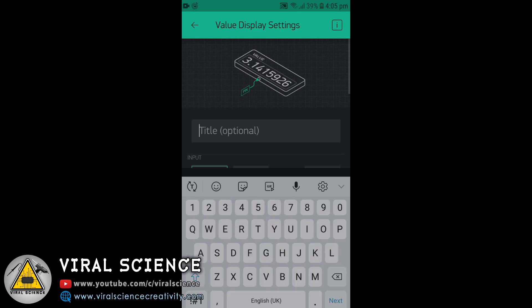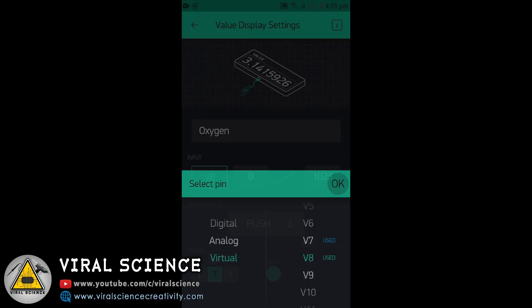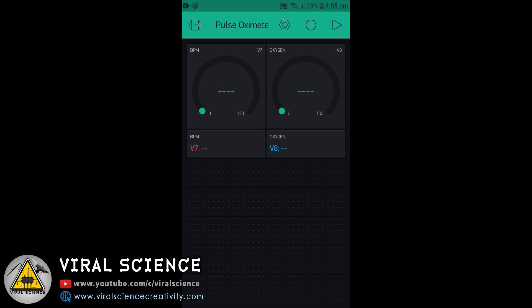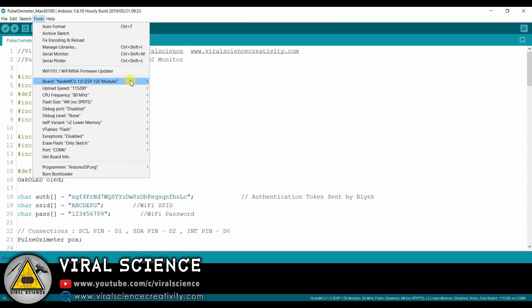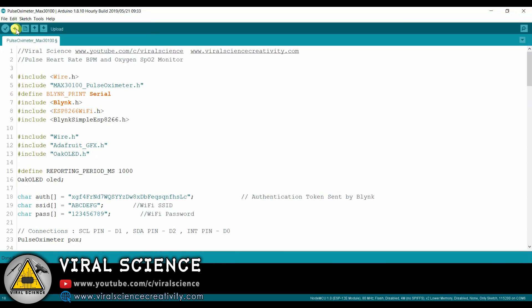We will set one second to all of them. Same we will do for the value display settings with the same pin V8, same values 0 to 100, one second and color. That's it with the application. Now open the code — first we will enter the WiFi name and the WiFi password. Enter your home's WiFi name and your WiFi password. Now we will enter the authentication token sent to us by Blynk while making the app. Select the board, that is NodeMCU 12E, select the port, and upload the code.